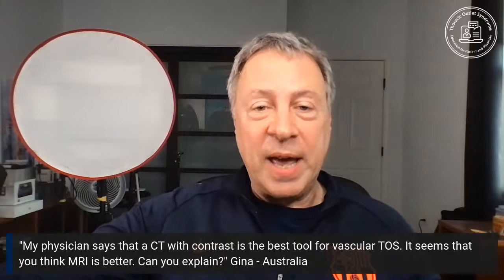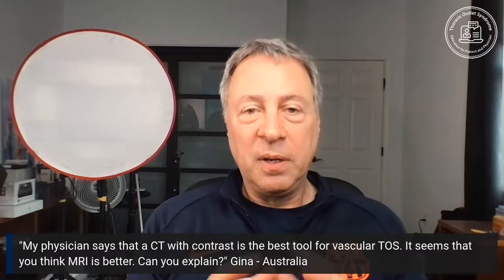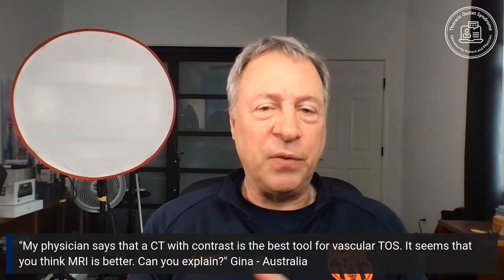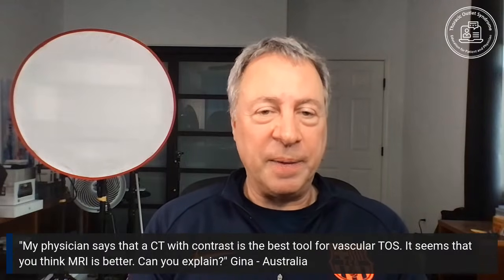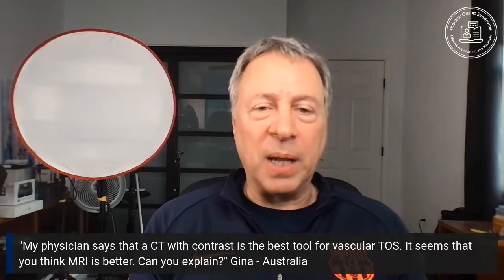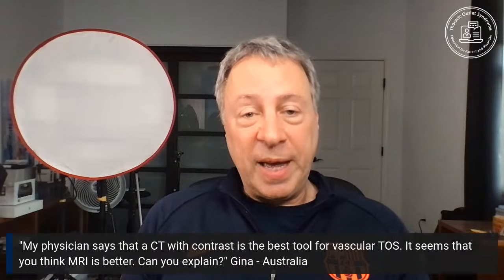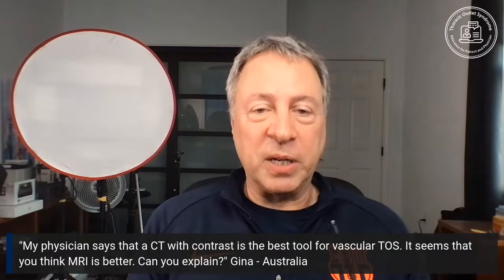Okay, so a CT scan has certain advantages and disadvantages in general relative to MRI. To do an angiogram, you have to inject dye or contrast. If your kidneys are in good shape, it's not a problem. If you have a little bit of kidney dysfunction, you have to be careful when you administer this X-ray dye. Also, a CAT scan gives you a pretty high dose of radiation. Not a problem for a one-time scan, but every dose of radiation you get should be thought through carefully. Now, MRI doesn't give radiation, and the dye that it uses does less damage to the kidneys. It's a safer dye to administer.